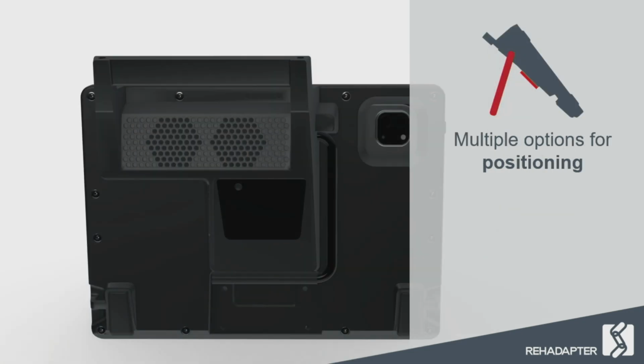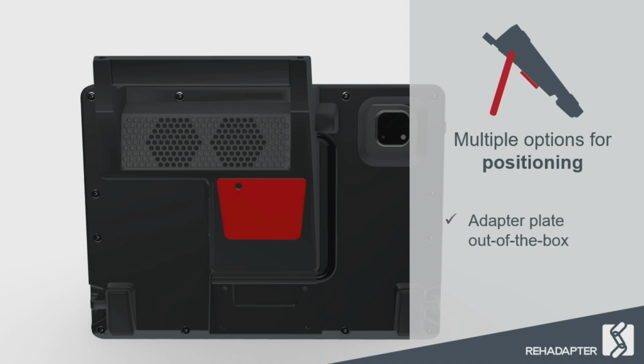Okay, when it comes to the positioning of the devices, the positioning is the key for most of the customers to access their devices. And as you know that mounting is our specialty, we thought it only makes sense to include a mounting option inside the Rehadapter by default. So that's the reason why all of the Rehadapters have the Rehadapt adapter plate on the back side out of the box, to combine it with every Rehadapt UDS mounting system.